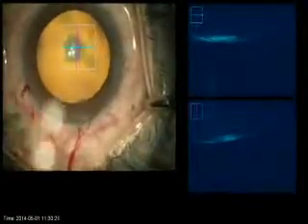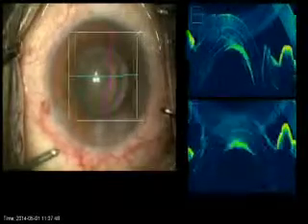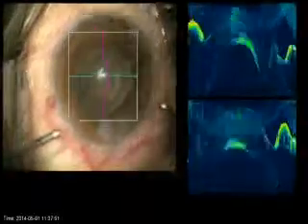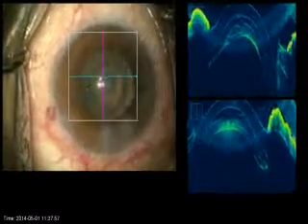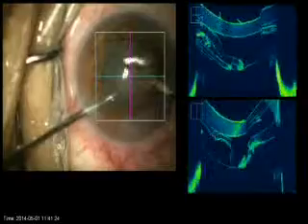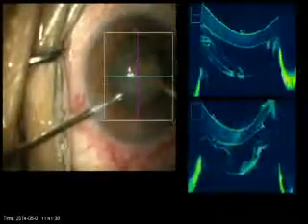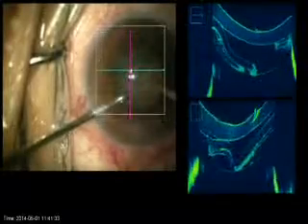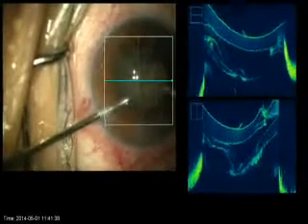The Rescan can also differentiate between suspected posterior polar cataract and true posterior polar cataract. A true PPC will not have clear space between the posterior capsule and lens. This case was a true PPC with the posterior epinuclear plate still attached to the capsule at the end of nucleus management.